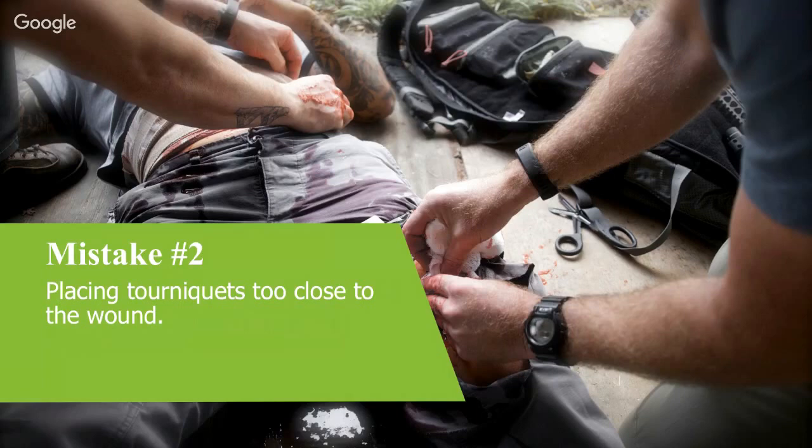But so not like the Black Hawk Down there, Dan, where the medic goes fishing in his femoral artery with the forceps. Well, look, it can, and that's high femoral injuries. That's something that you couldn't tourniquet. That's where we talk about our hemostatic dressings and junctional tourniquets. But certainly we can see a degree of arterial retraction.